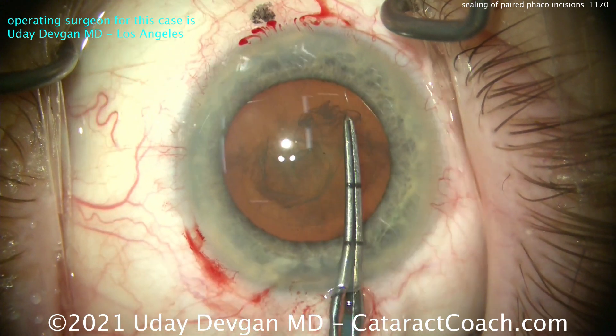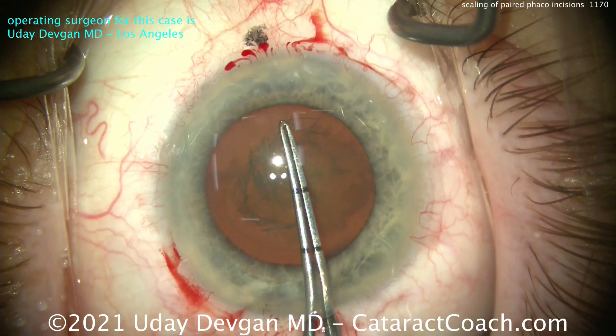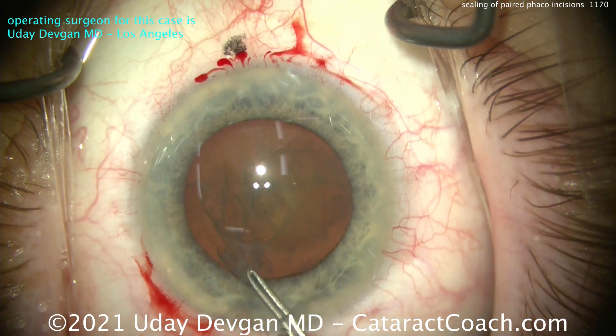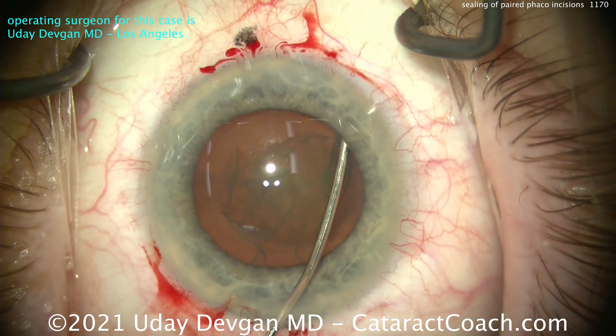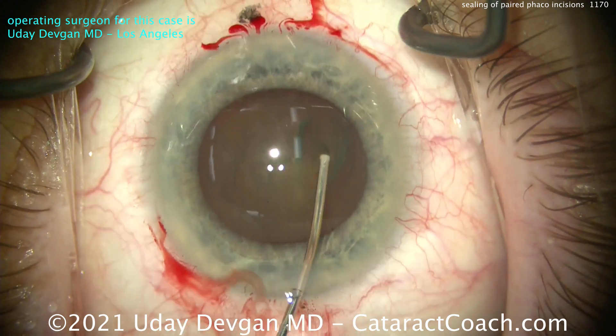Now remember, the main incision which we're using — we're putting forceps in it, balanced salt solution on a blunt cannula through it, the phaco probe through it, the IA probe through it, the IOL injector tip through it. We're going to use that main incision extensively. So I get it — you've got to seal that up. But the other incision there, where you see a little bit of bleeding at the top of your screen, we're not going to use it at all.